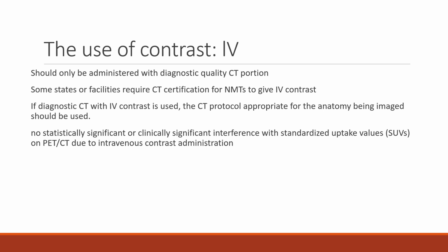So you don't have good enough image quality to really risk giving the IV contrast, but also you don't really get the benefit from it because you have low quality images. So IV contrast should only be administered when diagnostic quality CT is used. Now, some states or facilities require CT certification for nuclear medicine technologists to give IV contrast. So it is important to know your state regulations, also advocate for yourself.